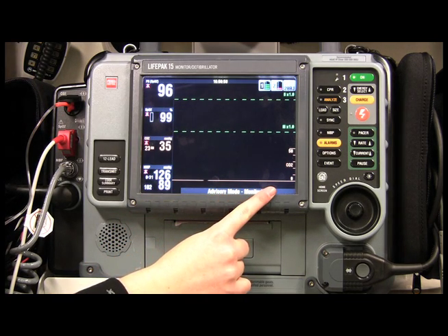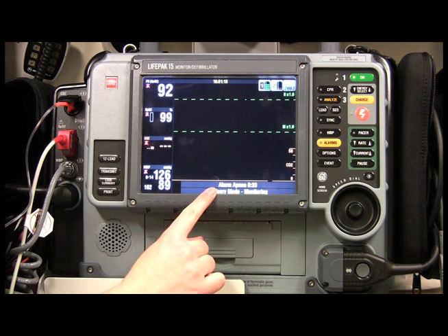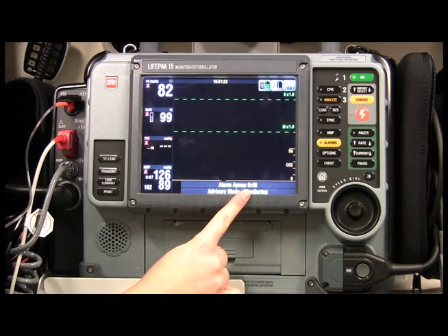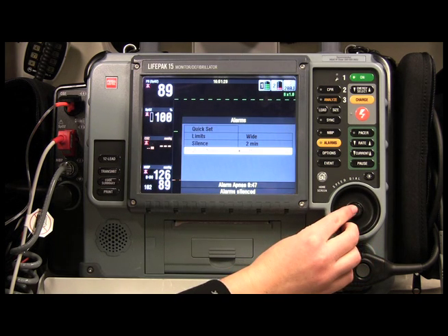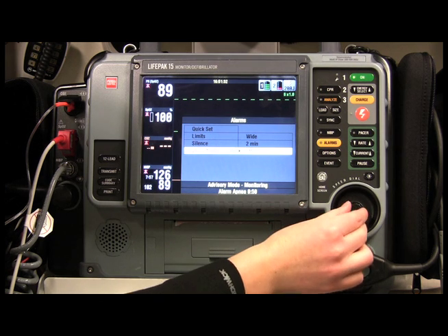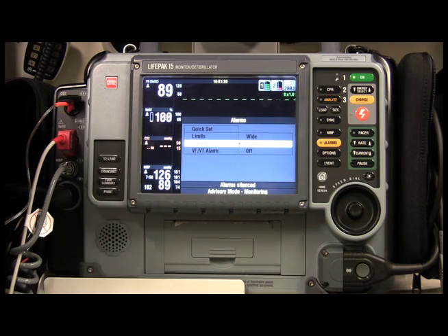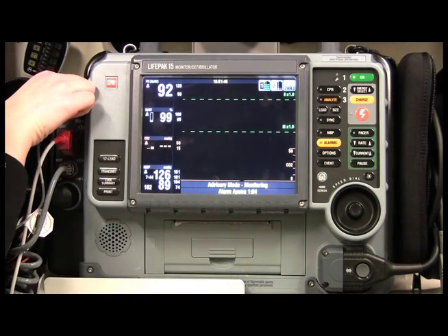I've now removed the capnography cannula from my face, so you're seeing a flat line. If you're monitoring a patient and they suddenly stop breathing, the monitor will alert you in about 30 seconds. As you can see, we now have an Apnea alarm counting how long past 30 seconds. To shut it off, go up to Alarms and silence it, or you can simply unplug the capnography.